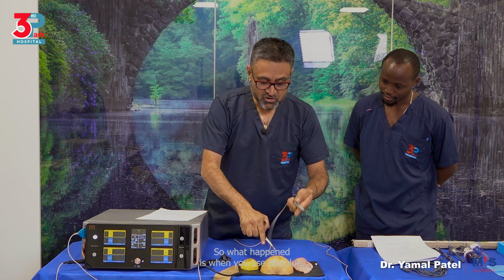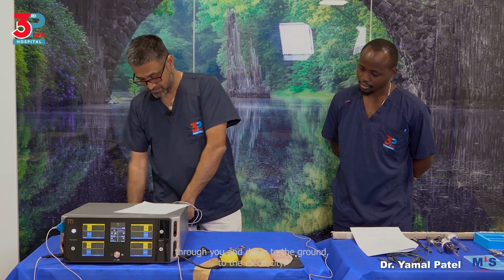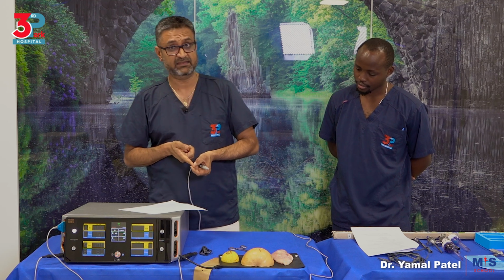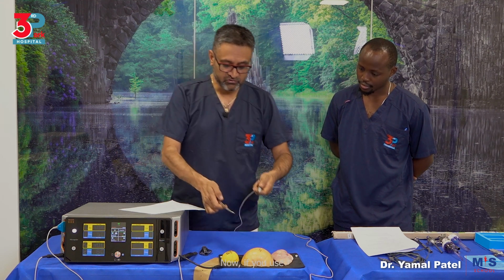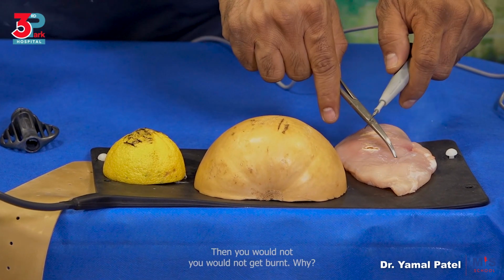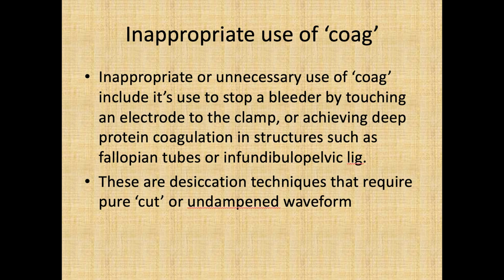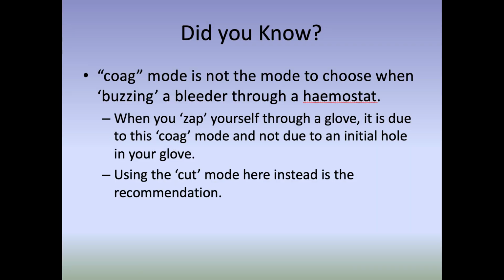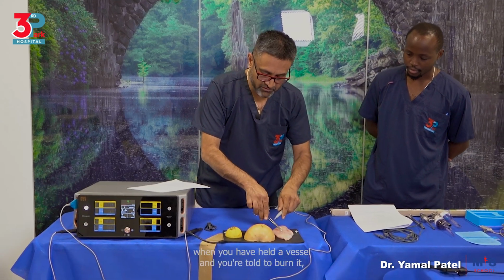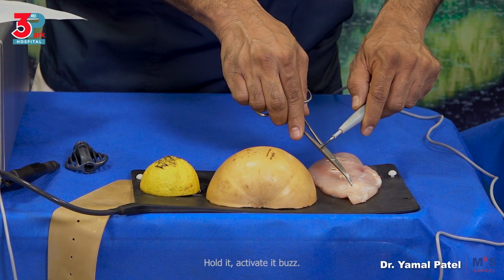What happened is when you used the blue, a stray current found a way out through you and down to the ground. So that is what caused your burn. It's not an electric shock, it's a burn. Now, if you use the yellow in that scenario, like this, you hold it and you use the yellow, then you would not get burnt. Why? Because it's a low voltage current, and you're supposed to use the low voltage current to buzz that vessel. So it's very important that you understand when you have held a vessel and you have been told to burn it, you would use the yellow and it will burn the vessel, exactly what you saw me do. Hold it, activate it, and it burns.